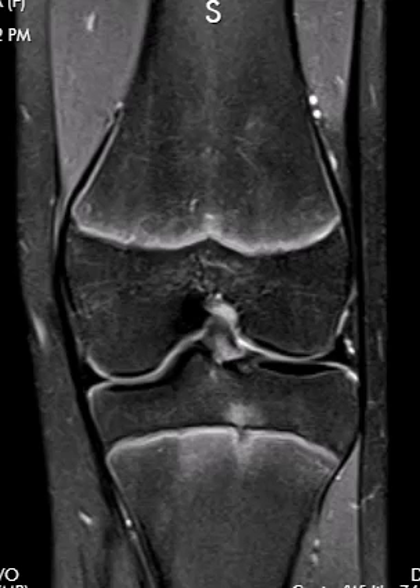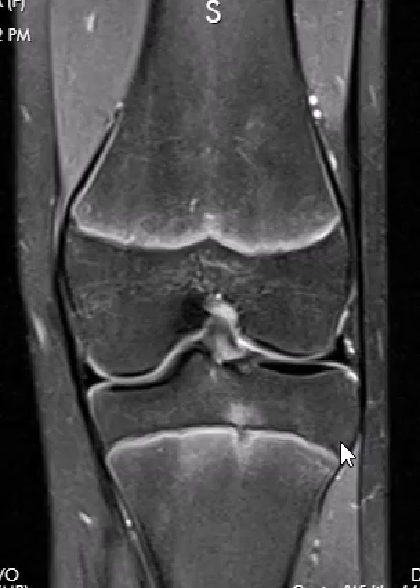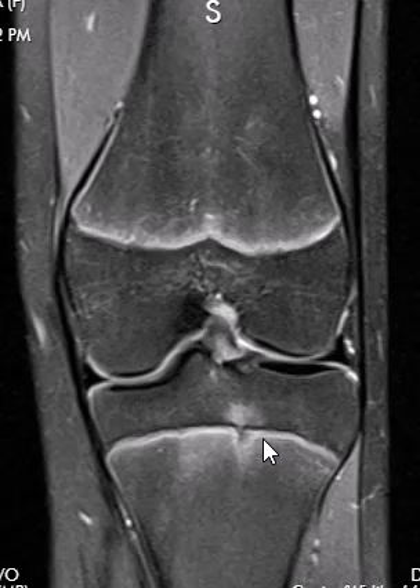Hello, this is Dr. Gay from First Look MRI. This is a patient who is 14 years old, female, and she has knee pain. Everything else looked pretty normal, and she had one minor finding here. We see this pretty regularly — this is a zone of marrow edema in the tibia, right adjacent to the growth plate.